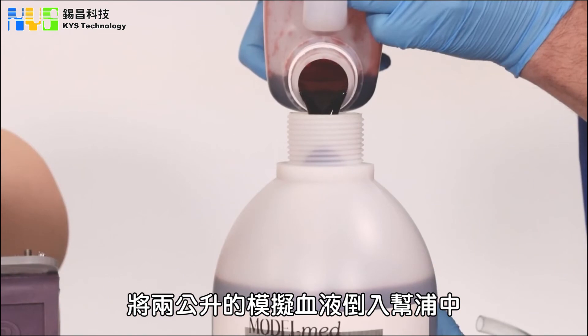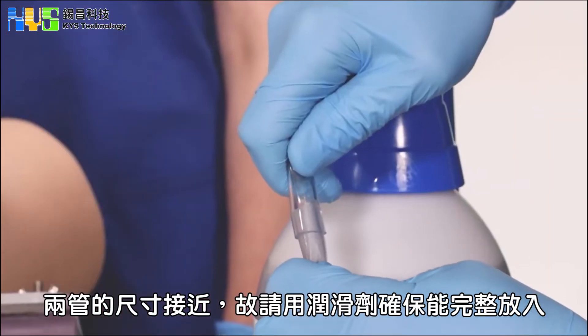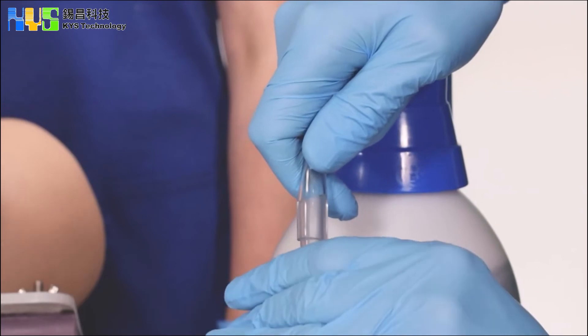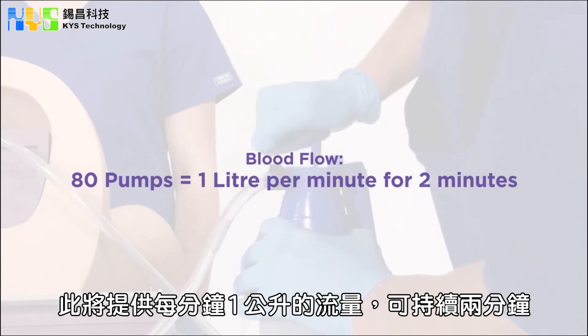You then fill the pump with two litres of blood. Attach the high or low bleed point tube. It's a tight fit, so use a small amount of lubrication as required. To get the correct level of flow, pump the handle 80 times. This will give a blood flow of one litre per minute for two minutes.